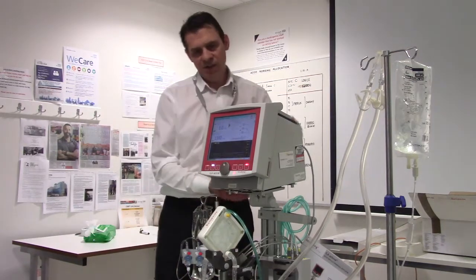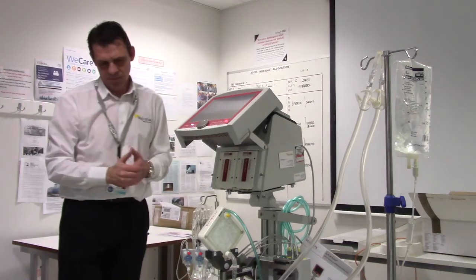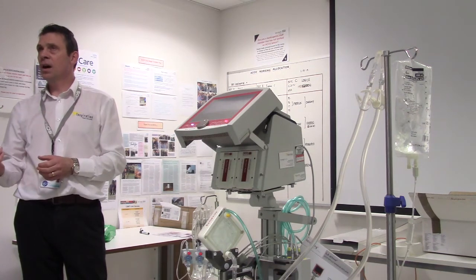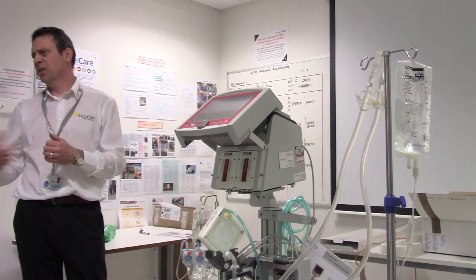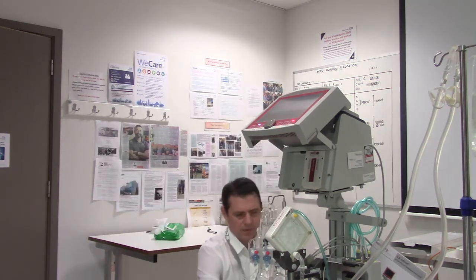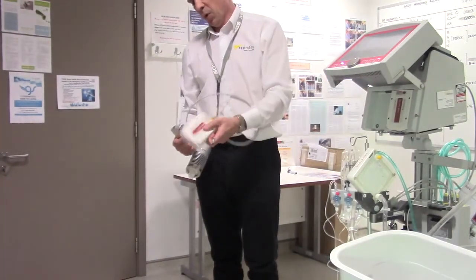If you don't want to take the machine with the patient, you can disconnect. But unlike a CVVH filter where you can let it recirculate, once you're in with this system you're committed — you can't really disconnect and do anything else. Arguably you could bung the cannula ends with a large bladder syringe, but that's risky and you wouldn't do that except in a true emergency. The batteries can also be hot-swapped here.